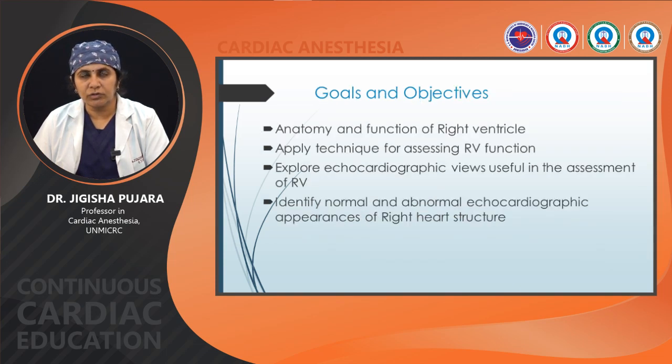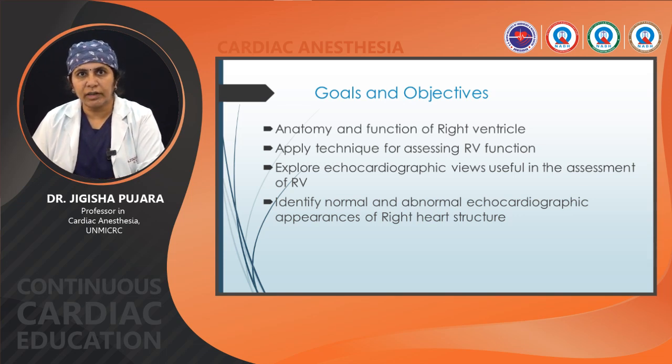Goals and objectives of this talk are: anatomy and function of the right ventricle, apply the technique for assessment of the right ventricular function, explore the echocardiographic views useful in the assessment of the RV, identify normal and abnormal echocardiographic appearance of the right heart structure.